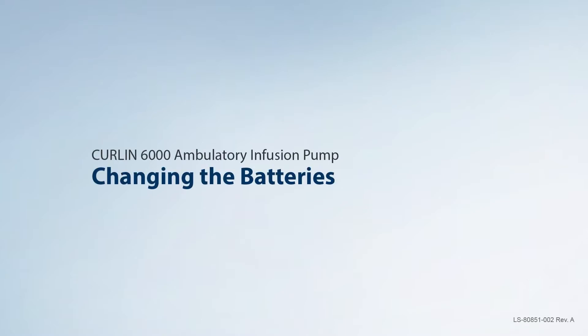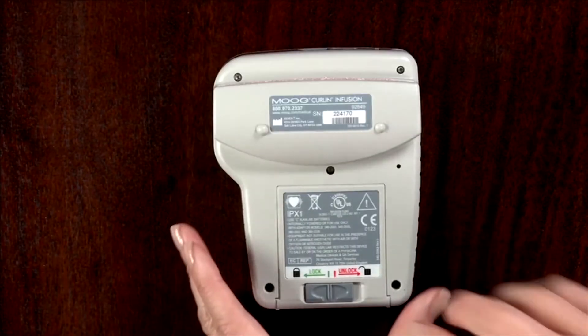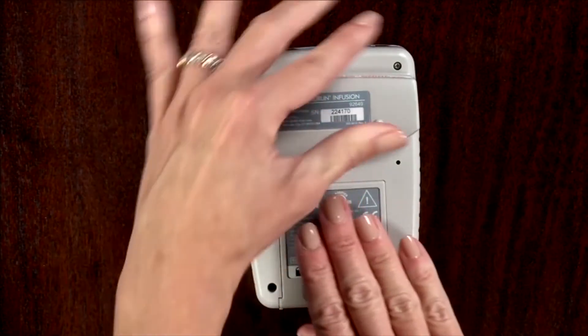Changing the batteries. The pump must be turned off prior to changing the batteries. Push the battery door slider to the unlocked position and slide the door off.